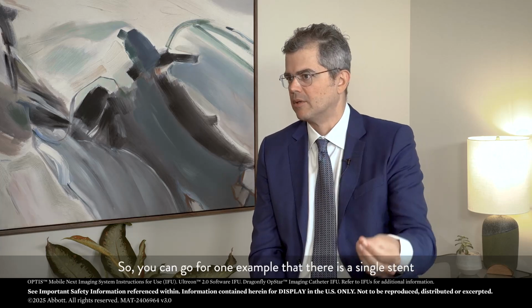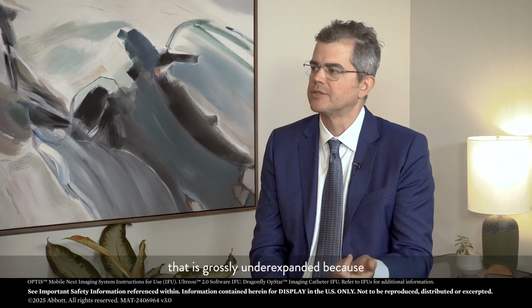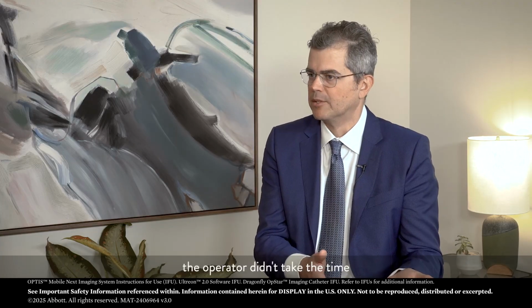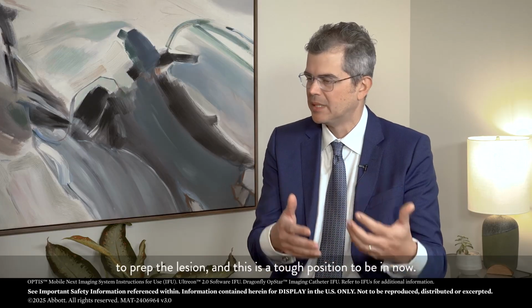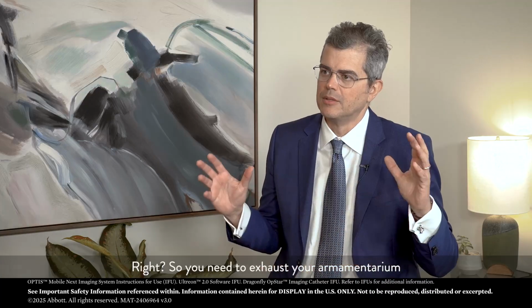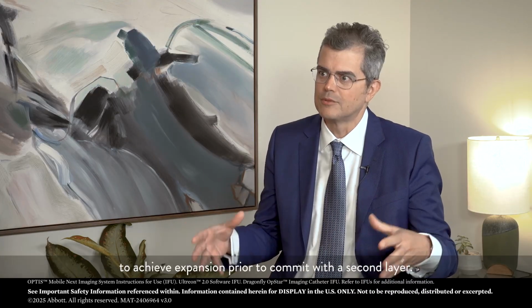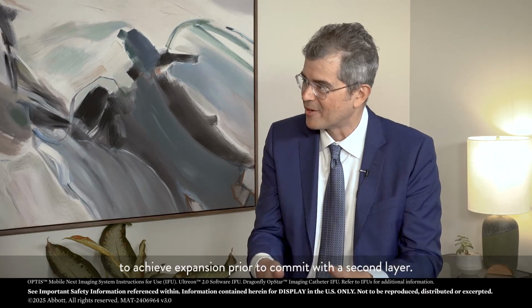So you can go from one example where there is a single stent that is grossly underexpanded because the operator didn't take the time to prep the lesion, and this is a tough position to be in, right? So you need to exhaust your armamentarium to achieve expansion prior to committing to a second layer.